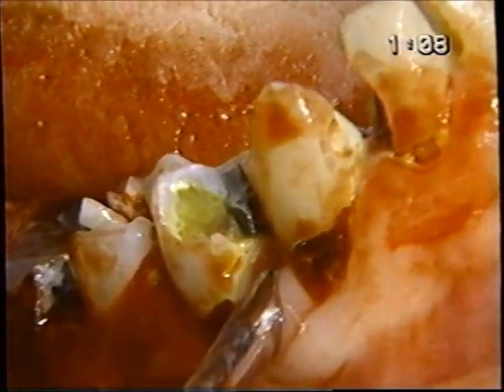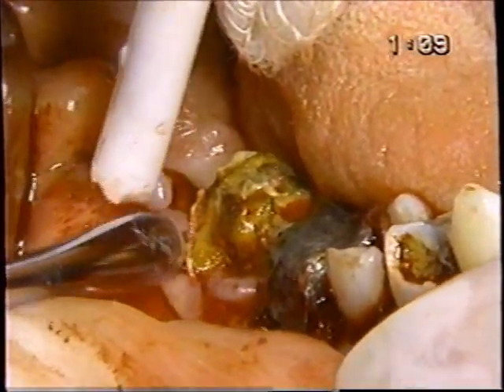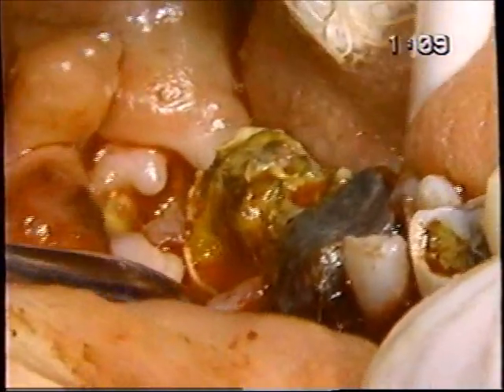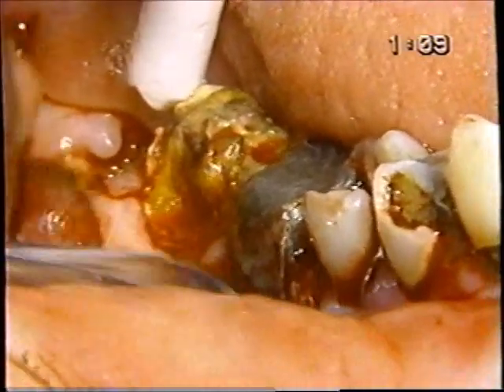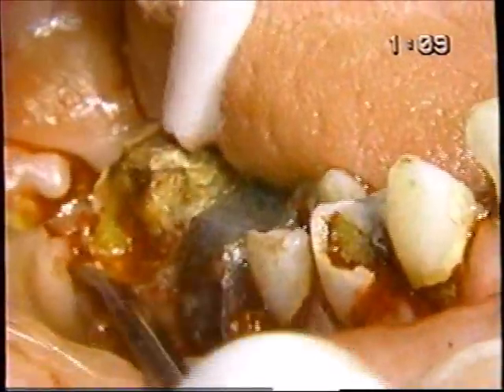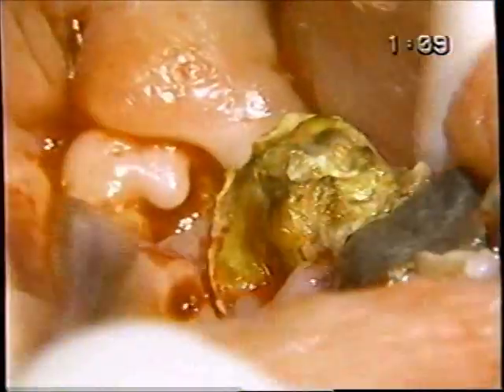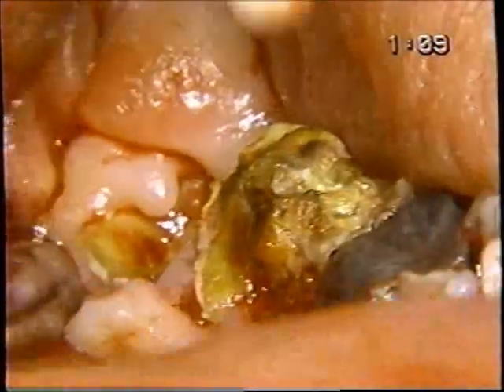Now this patient is sedated with the Valium and Meprigan Fortis, which consists of Demerol and Phenergan. All of those have sedative properties. With the papillae cut, we will now use the periosteal elevator and make sure we have cervical reflections on the facial aspects. Not a great deal of reflection, but just enough that we can engage the forceps down to the bone level.